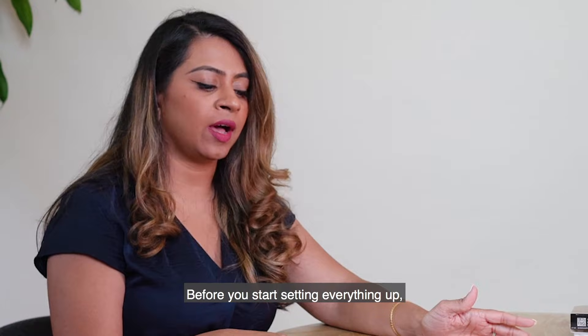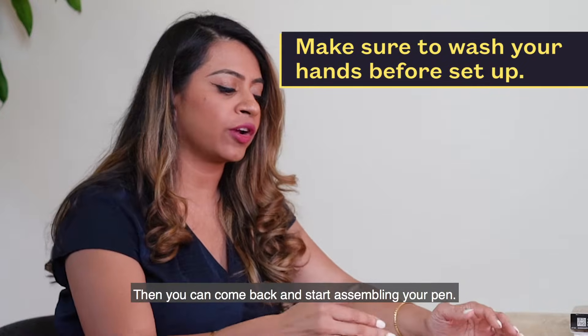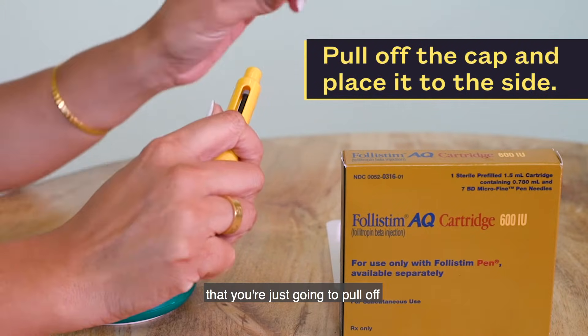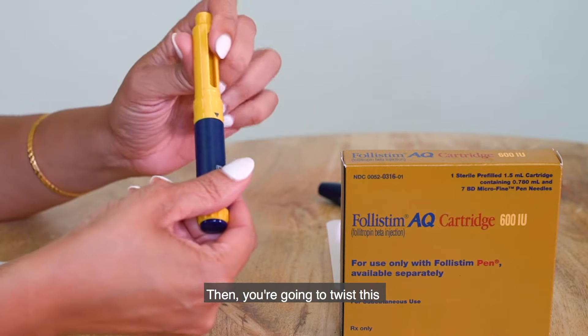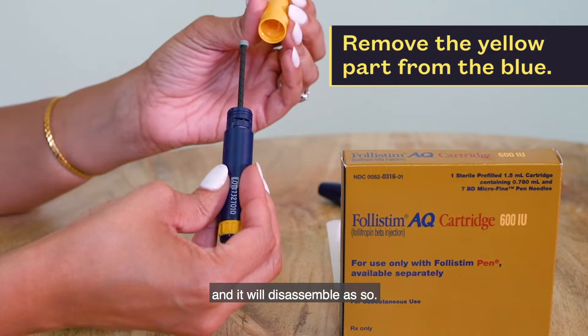Before you start setting everything up, make sure that you wash your hands thoroughly. Then come back and start assembling your pen. The pen has a cap, just like a regular pen, that you're going to pull off and place to the side. Then you're going to twist the yellow portion of the pen away from the blue and it will disassemble.